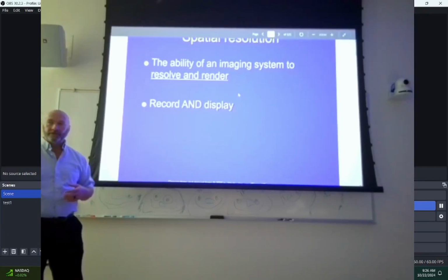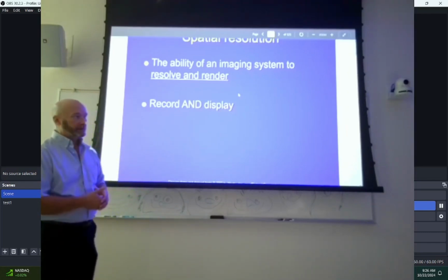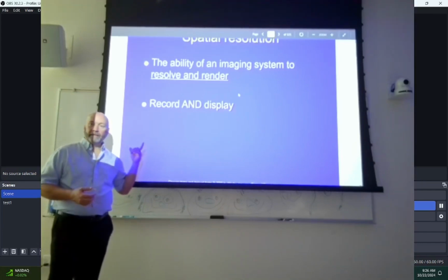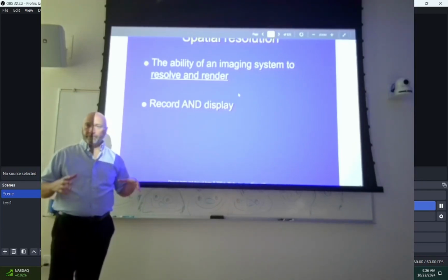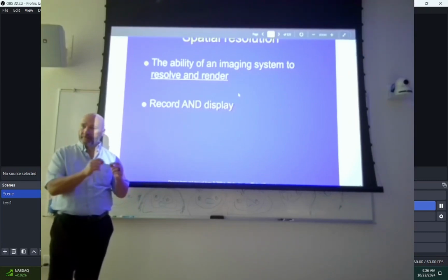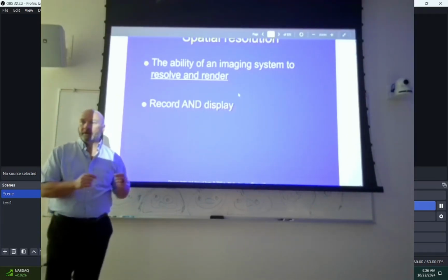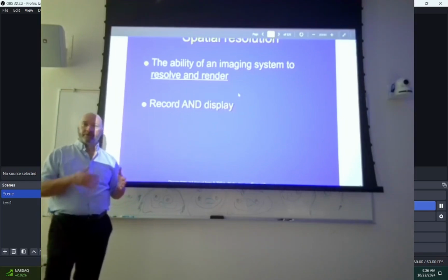We've got the positioning things that we've talked about throughout the curriculum, OID, SID, those things that can affect it. But we've also got the image receptors. Our current image receptors are made up of individual small pieces, small image receptors. And the more of those that we have, the sharper the image.